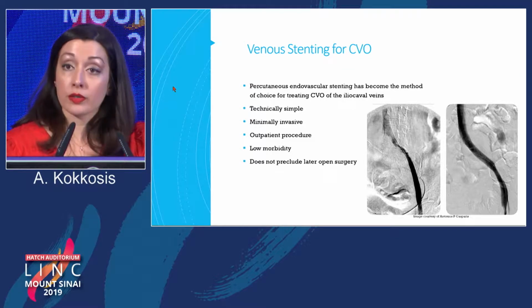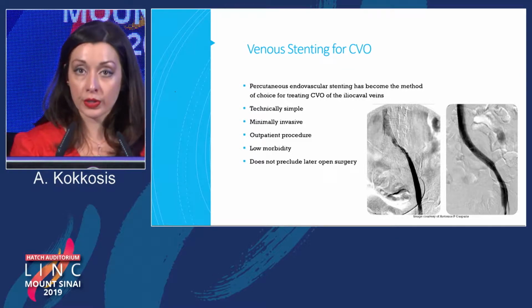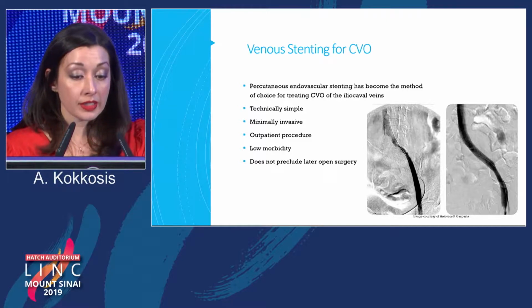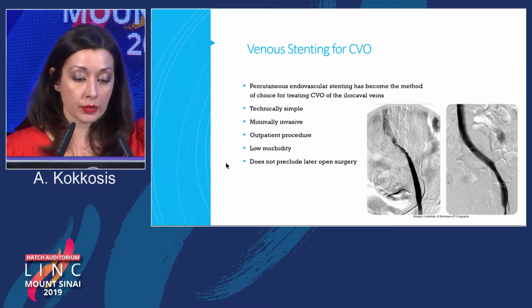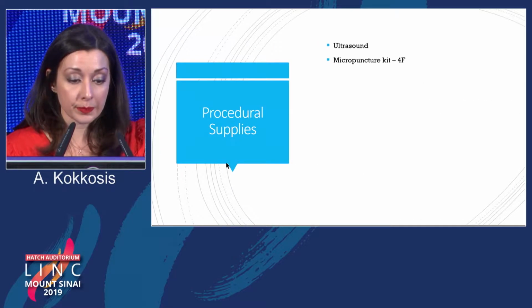Percutaneous endovascular stenting has become the method of choice for treating these chronic occlusions. Technically, it's simple, it's minimally invasive, it can be an outpatient procedure, morbidity is fairly low, and it does not preclude later open surgery if necessary.